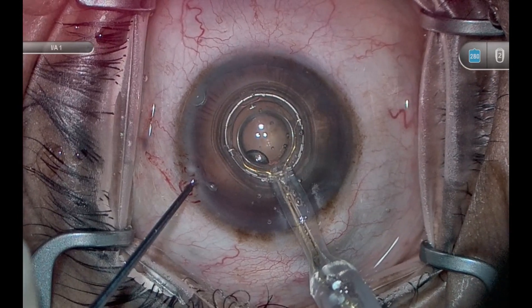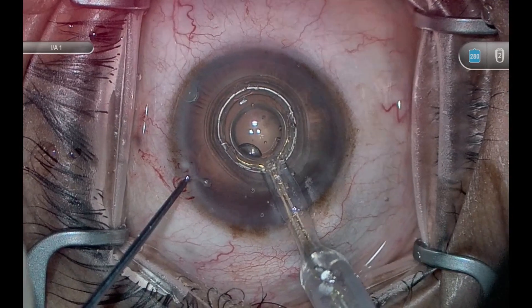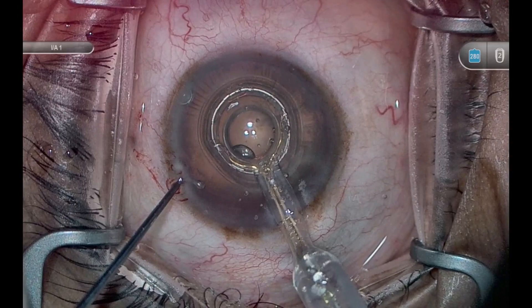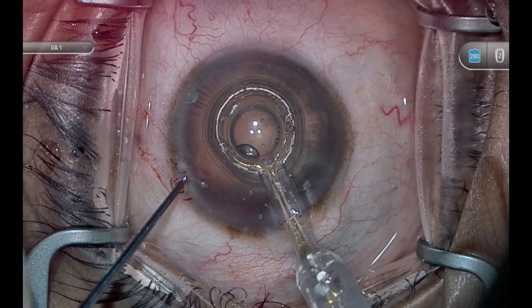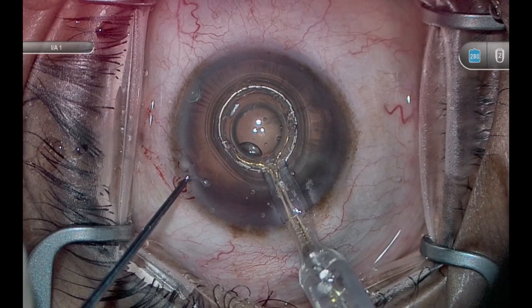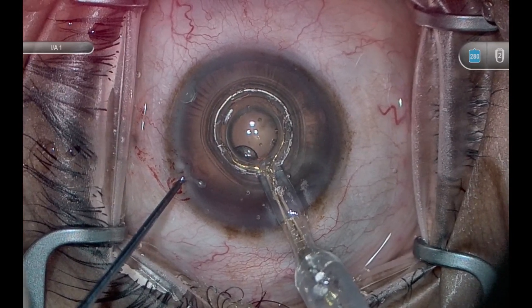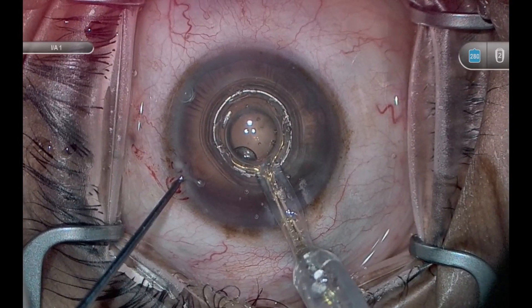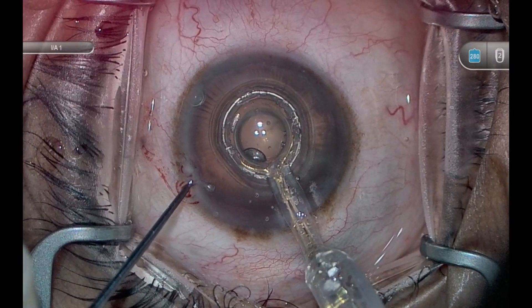Then I use my other hand to make sure that the Zeptoe is well-centered. Once I'm good with where the Zeptoe is located, I'll go ahead and retract the pushrod a little bit further, so get it beyond the wound. At this point, you can tilt up a little bit to make sure that the Zeptoe is flat against the anterior capsule. Once it's flat against the anterior capsule, go ahead and hit suction. We use Zeptoe Link, so everything's controlled by my foot pedal. Once you've got suction, Zeptoe will tell you to retract the pushrod the rest of the way, and then after several seconds, Zeptoe will be complete.